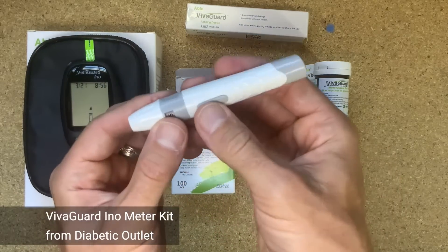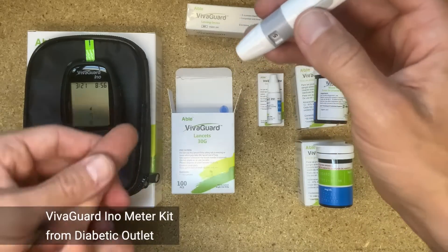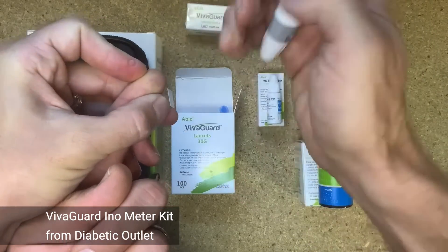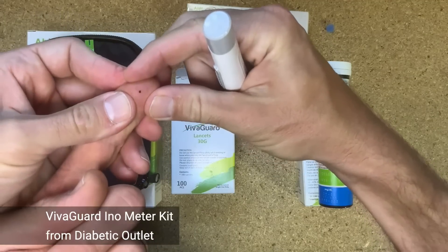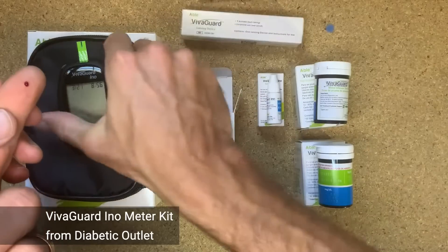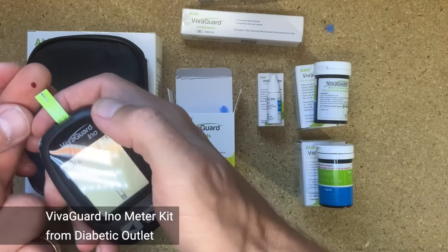I will borrow the finger of the head of Diabetic Outlet. And let's see how much blood this meter needs.